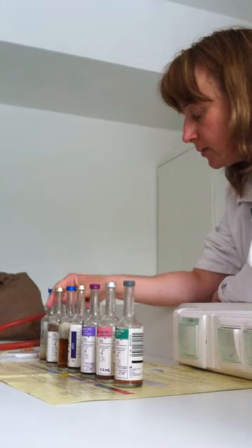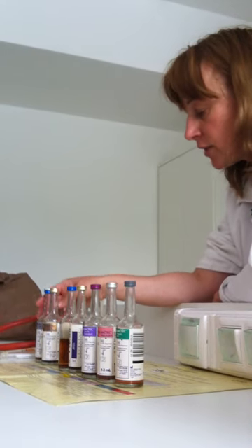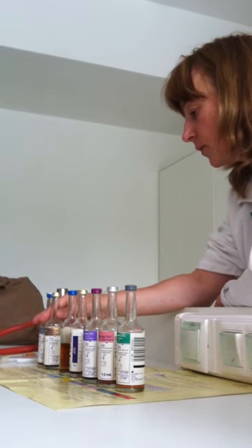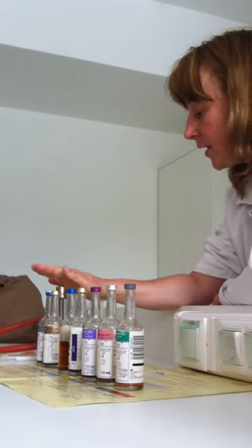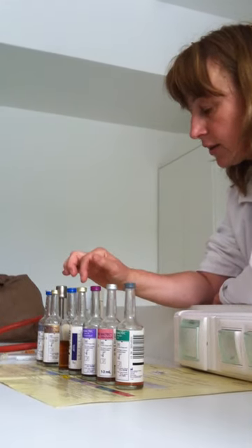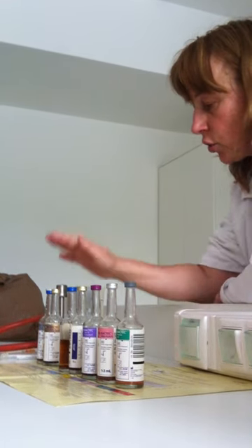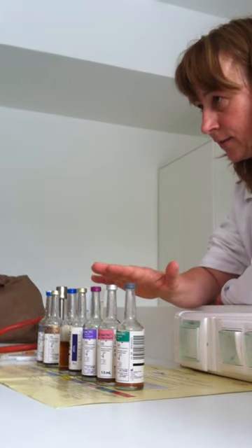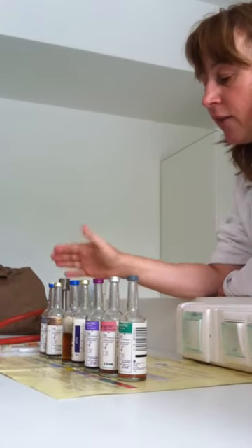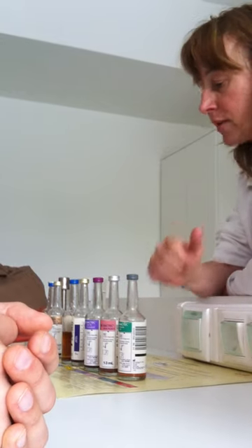Two bottles are needed. This means one set, one aerobic and one anaerobic. 5 to 10 milliliters into each of the two bottles, so altogether it means 10 or 20 milliliters. This is one set. 20 or 30 minutes later, you should collect another set, another new aerobic and anaerobic bottle. And again, 20 or 30 minutes later, you should collect the third one. So altogether, there will be three sets, always one aerobic and one anaerobic. Altogether, six bottles. If you collect more, it's a waste of time and money. It does not raise the positivity.